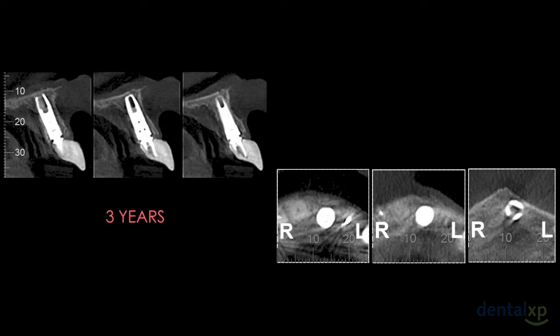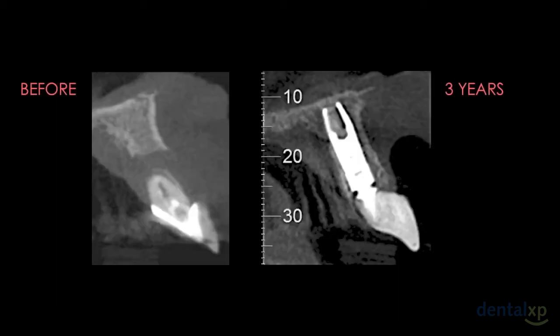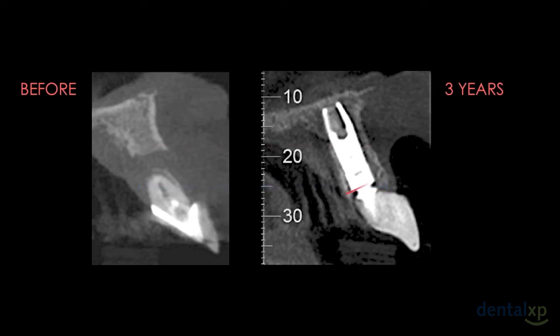Buccal and palatal bone remodeling at three years later is shown. Comparing before and after bone reconstruction using the IDR technique, we can see the height of the bone reconstructed. Note the bone reconstructed above the implant platform in both buccal and palatal aspects — the bone graft placed above the implant platform is still present.